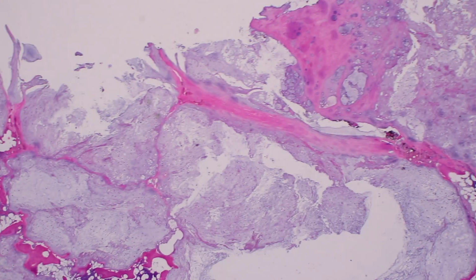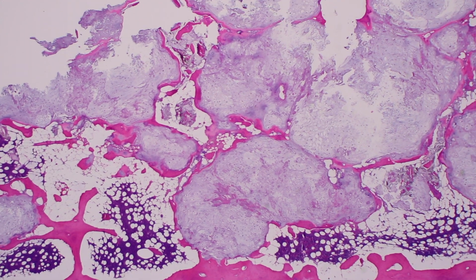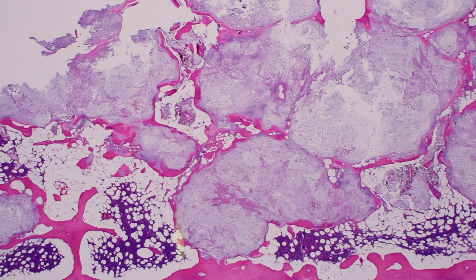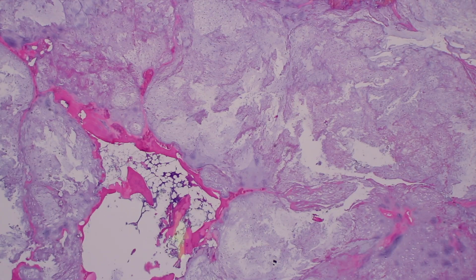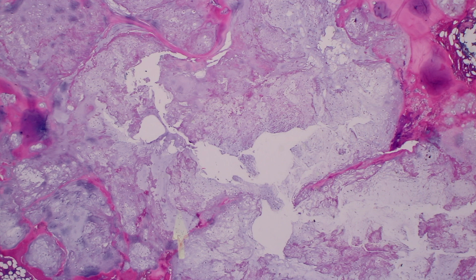Okay, so what we're looking at here is a cartilage neoplasm. Cartilage neoplasms, certainly those that are intraosseous in location, grow architecturally as multiple nodules. And you can see individual nodules here at low power that are sharply delineated by a rim of reactive bone that is being deposited, if you will, to try in some sense to confine its growth. Over a period of time, those nodules can coalesce, forming large masses of cartilaginous tissue.